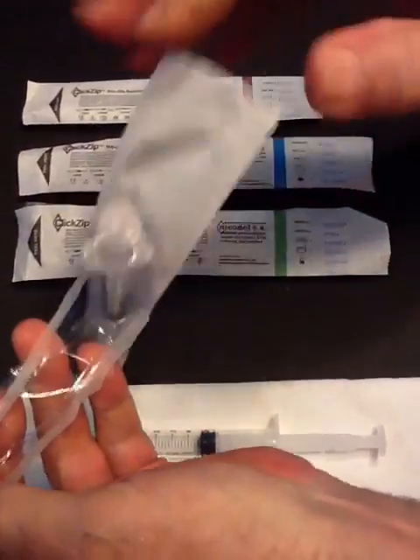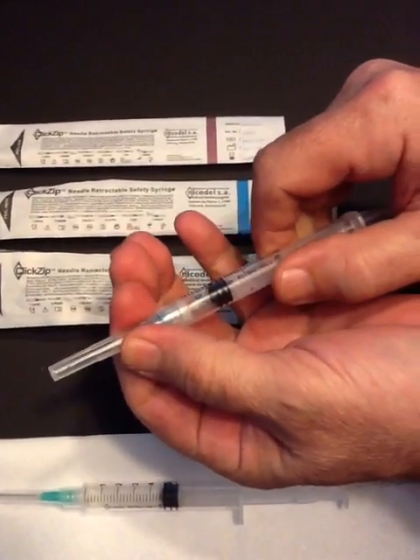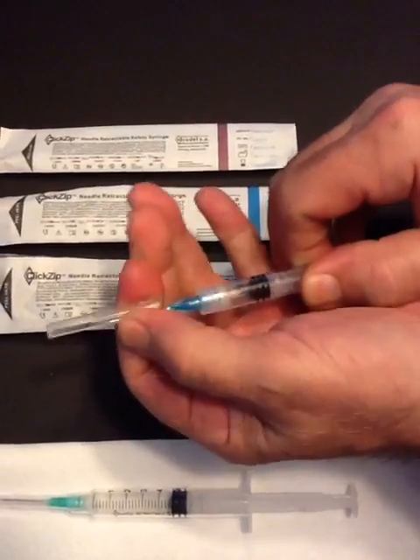Open the product. Make sure that the lure lock needle is properly screwed in the barrel and pull off the cap.